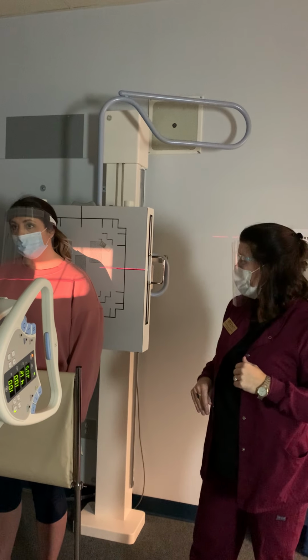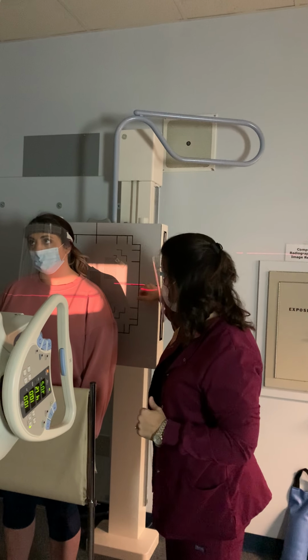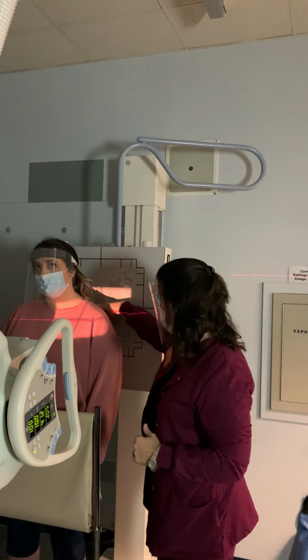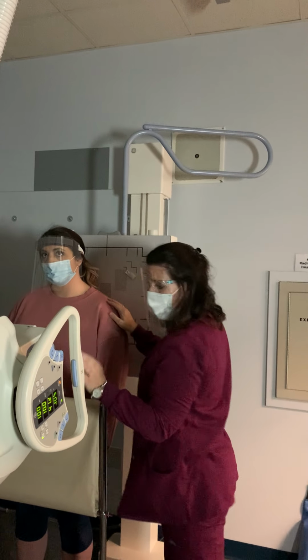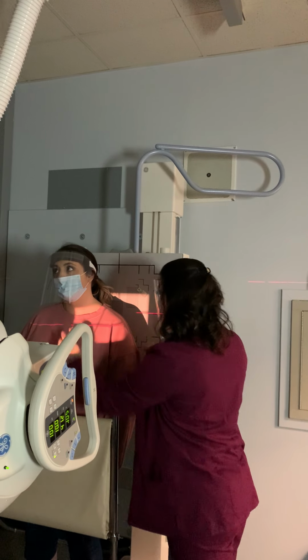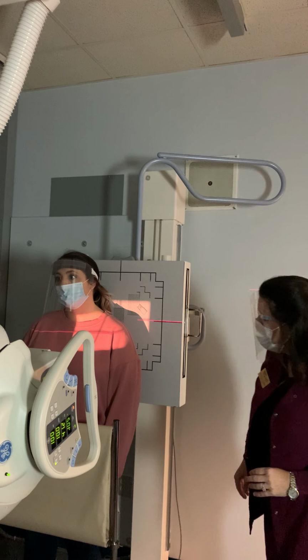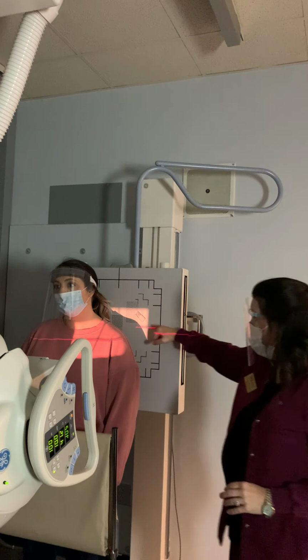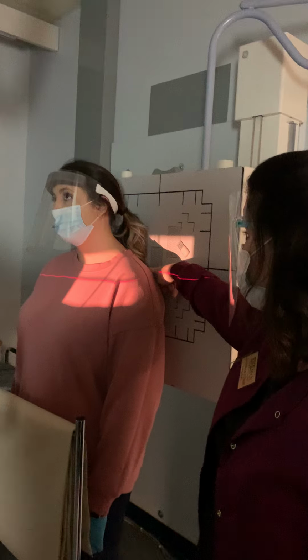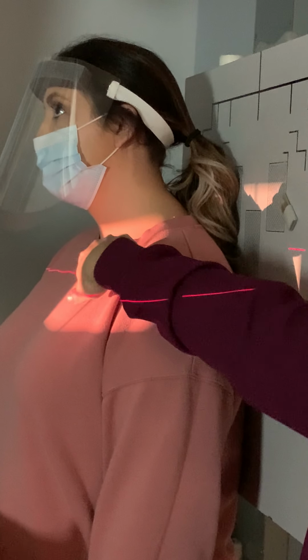You with me? So I'm making sure that I'm coming out right over the clavicle area. So I have a 15-degree cephalic angle for AP. So you want that line above the clavicle? Was it exiting? No, I want it to be about right at the clavicle. It's a little bit above right here. See? Her clavicle is right there. So I'm coming out about the same level up as the clavicle.